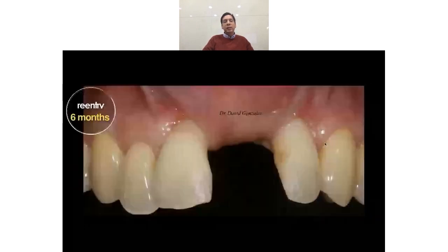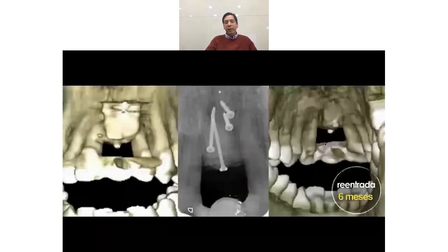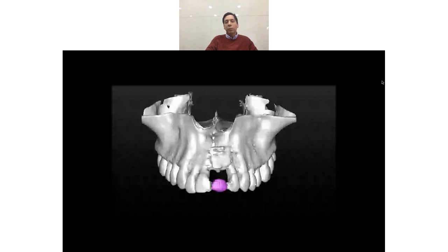Donor area, and this is the aspect 6 months later. We have moved the mucogingival line, of course, but it doesn't matter at this time. We take a CBCT, we see this radiopacity, the bone is totally radiopaque. We can see here the buccal block, the coronal block, and the palatal block.